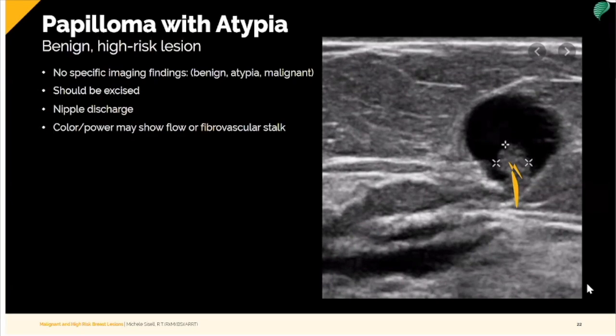Make sure you're using very light transducer pressure. This is necessary, and it also is necessary to be patient. These are very, very small vessels if we do have some type of vascularity going into the solid lesion. So light compression and holding still with patients will help us to get that blood flow.